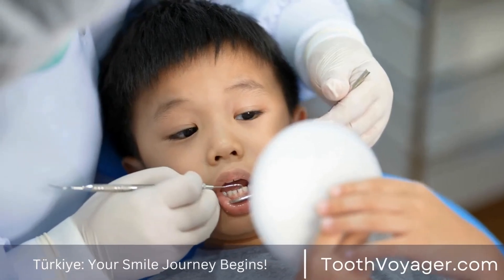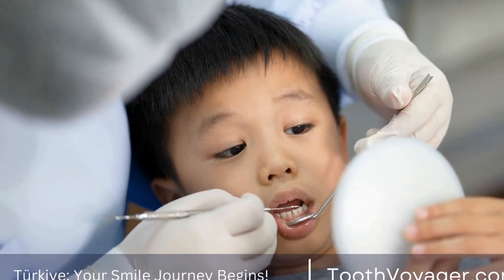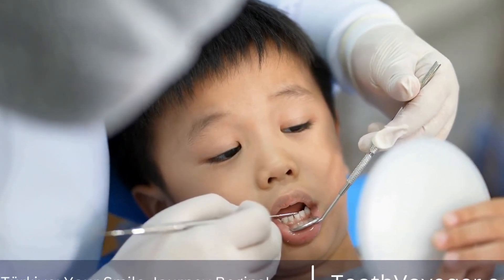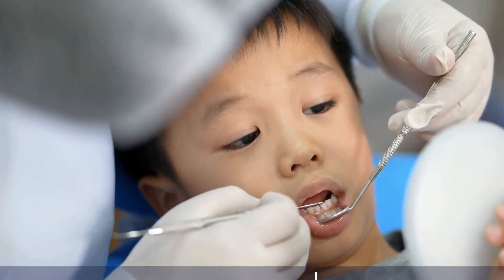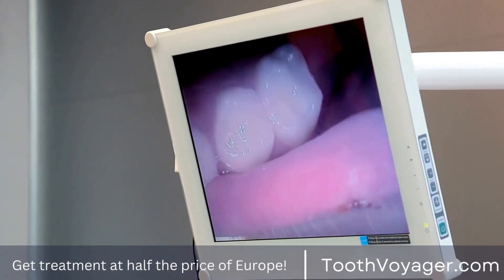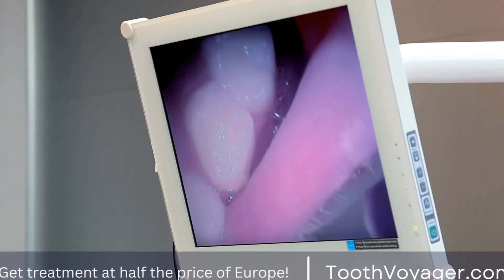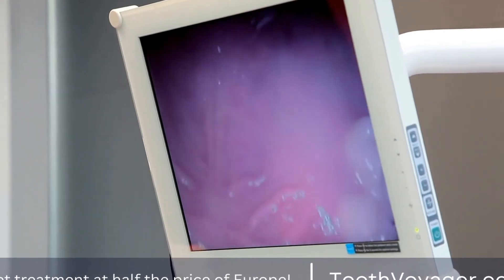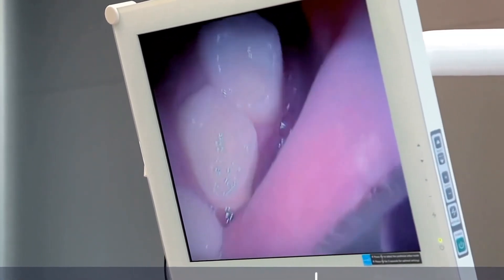Zygomatic dental implants offer a unique solution for patients with severe bone loss or those who have been told they are not candidates for traditional implants. While zygomatic implants require a more complex surgical procedure, they can provide patients with a functional and aesthetically pleasing smile.